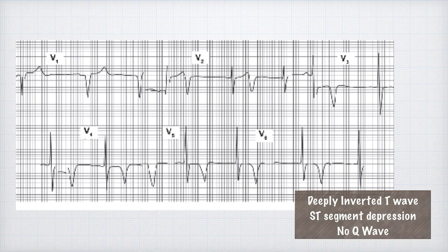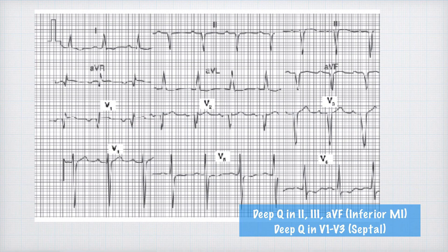Example ECG 1: deeply inverted T waves in chest leads V1 to V6, ST segment depression, and absent Q waves — diagnosis is NSTEMI or subendocardial ischemia. Example ECG 2: deep Q waves in leads II, III, and aVF representing inferior MI, and deep Q waves in leads V1 to V3 showing septal MI — this may be inferior MI with septal extension.